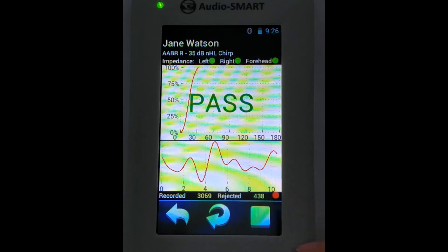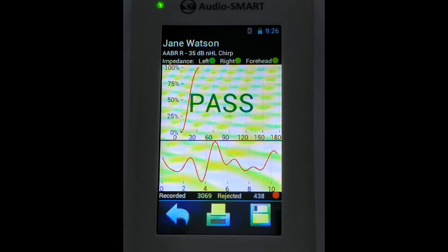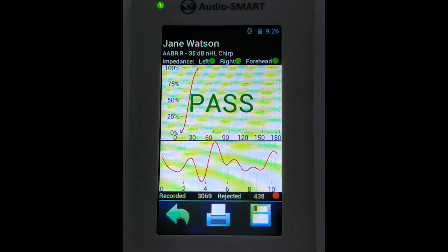We can save the result and print via a Bluetooth printer. After finishing, we can also export these results to the Neuro Audio Screen Manager program.